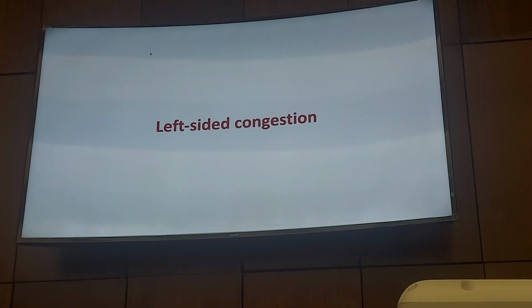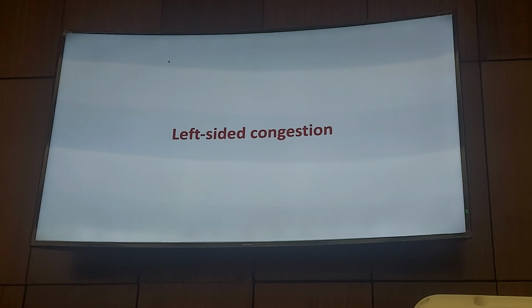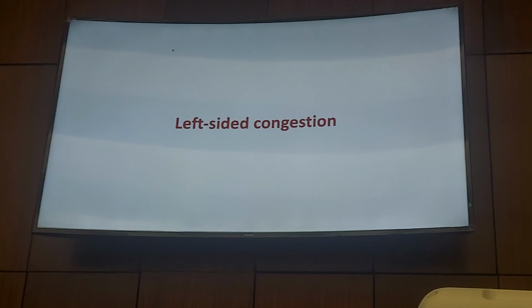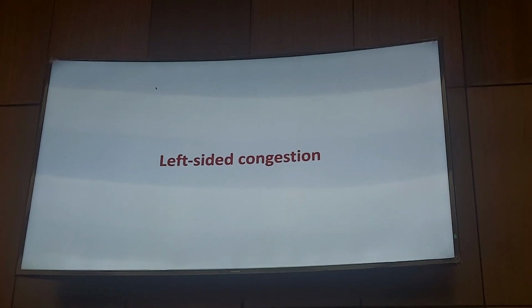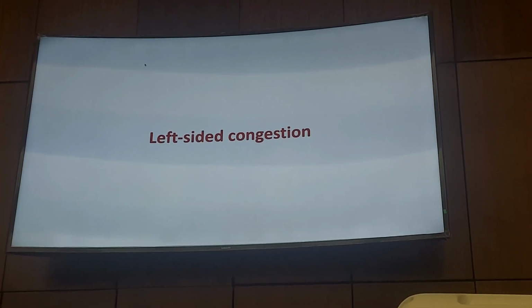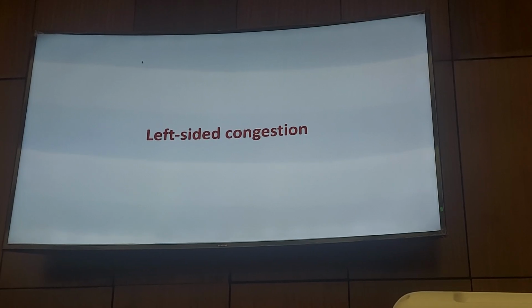My question is, is there a difference in doing VExUS in sinus rhythm versus AF? Very good question. Sinus rhythm versus AF will only change the A wave in the hepatic vein. You will not see the A wave, but it will not affect the portal vein, and it will not affect the renal vein. That's why again I call the portal vein the king. No ECG needed, no effect by arrhythmias, and no effect by tricuspid regurgitation.